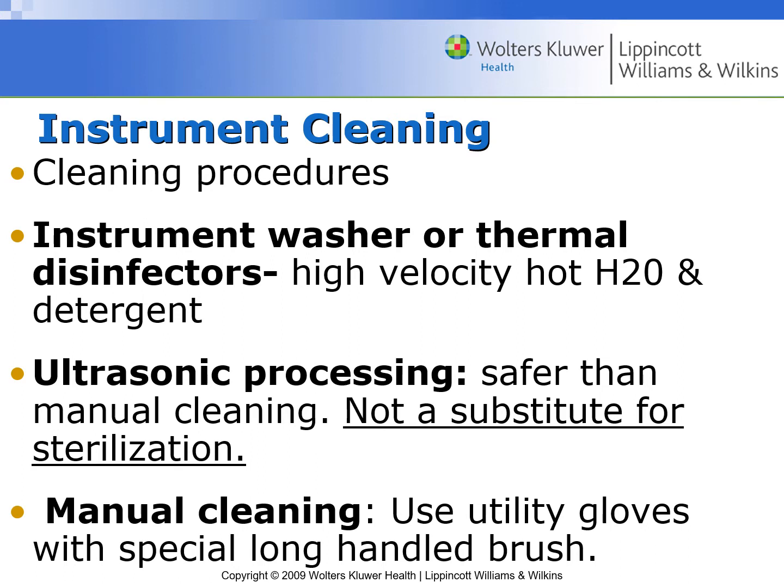The ultrasonic processor is definitely safer than manually cleaning. The ultrasonic processor is just a cleanser to shake, through the vibrations, any debris or particles off of your instruments. And it's not a substitute for sterilization. It doesn't mean it's sterilized. It's just hopefully cleaned off.